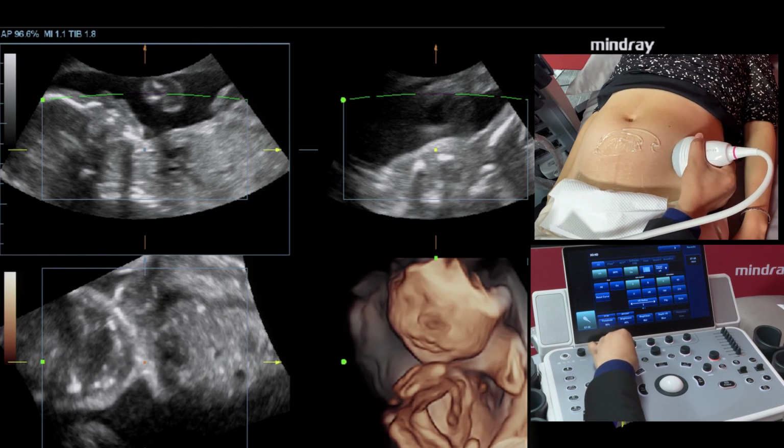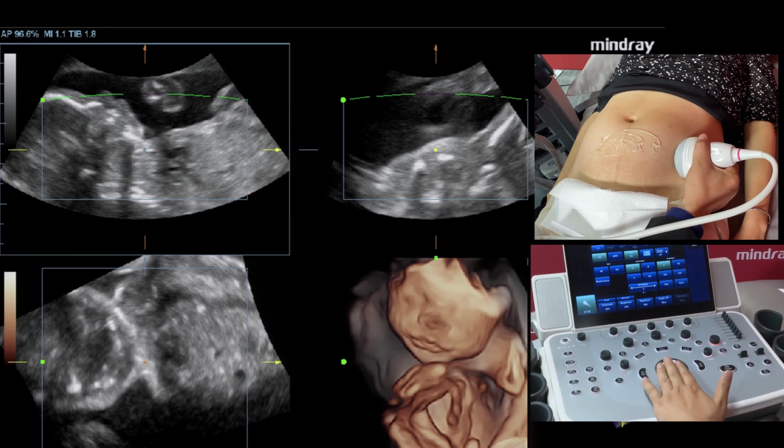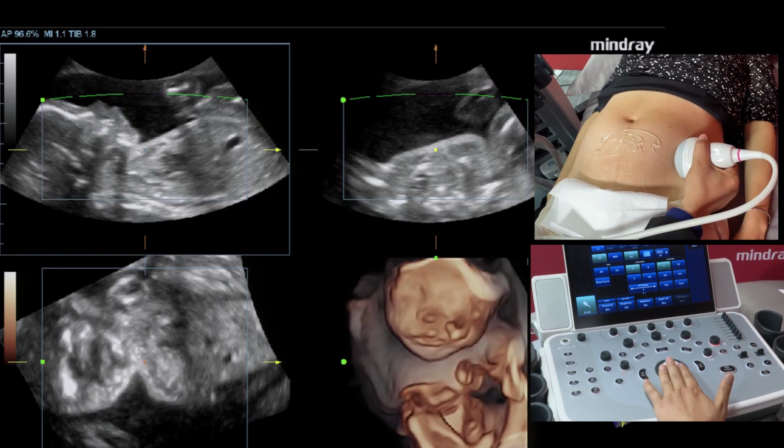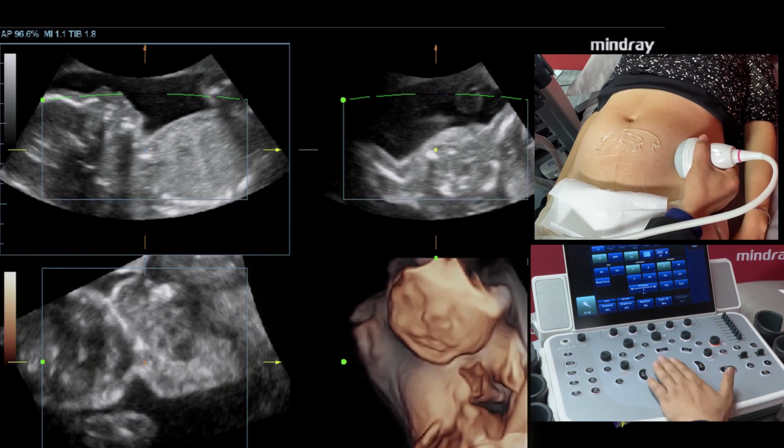Also, mostly you have to check your ROI box. So I think we have to change this box or move it or change the position. How to change it? You can see now we have the cursor here. We cannot do anything with it, but we want to move it. So touch this cursor button. Now here is the cine loop. Activate the cine loop.